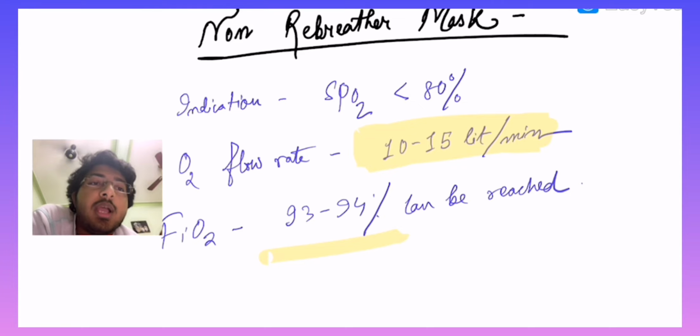And even in this case, if the patient is not having much peripheral oxygen saturation, then a hospital setup is needed. BiPAP can be done. It is only possible in a hospital setup, and further intubation can also be done. So this is my short video. I hope it will be beneficial for all of us, that if it's the need of the time that we need to set up an oxygen cylinder in our home, then it will be helpful.